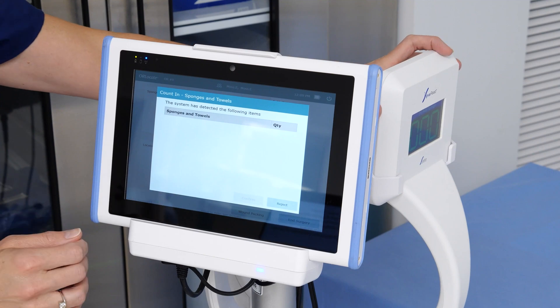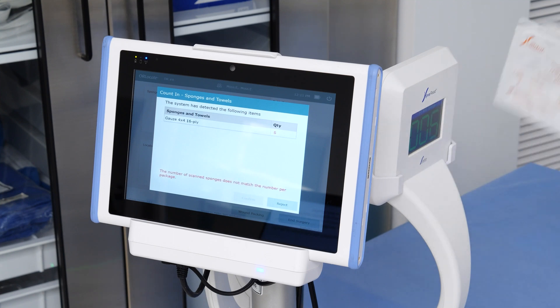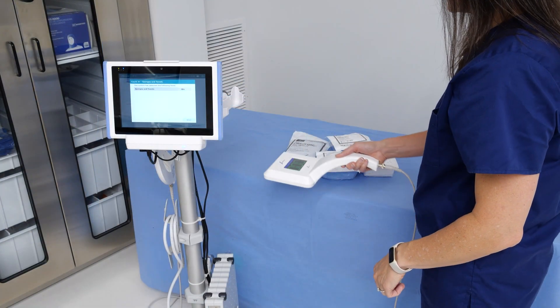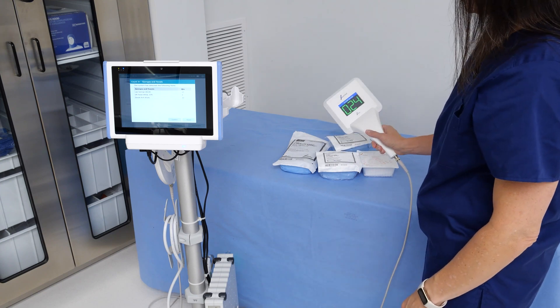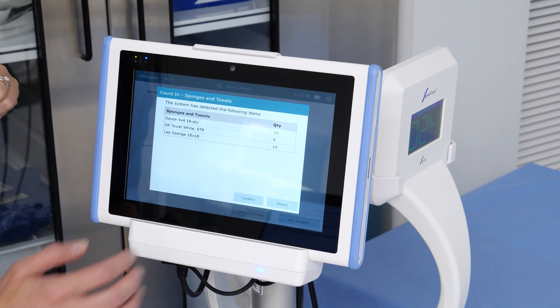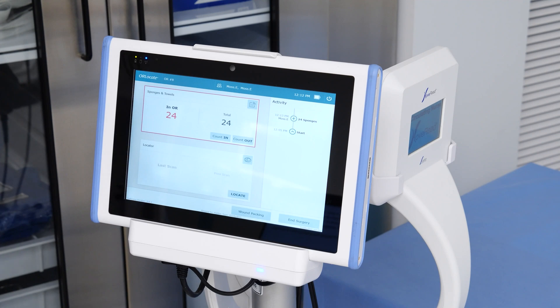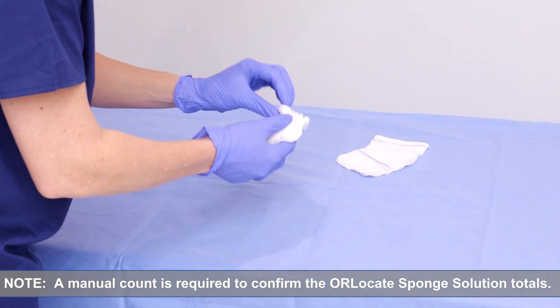Touch the Count In button in the upper left-hand window to count in sponges or towels. We will use the HoverRead to count in the sponges. Sponges can be counted in two ways: you can wave the pack across the back of the HoverRead, or you can remove the HoverRead from its cradle and wave it over the closed surgical packs. The back of the HoverRead will show the total number of sponges counted in, and the Panel PC will show a detailed list of the different types of sponges and towels scanned. When all items are scanned in, press the Confirm button. It is important to note that you must still complete a manual count to ensure all sponge and towel totals counted into the ORLocate system are verified.